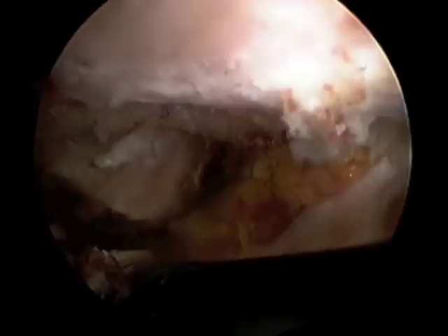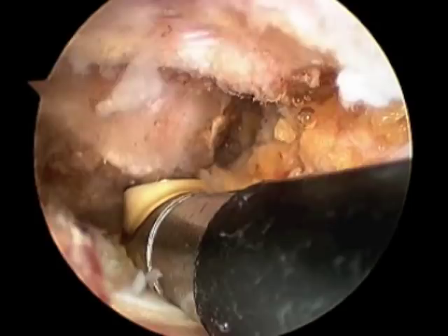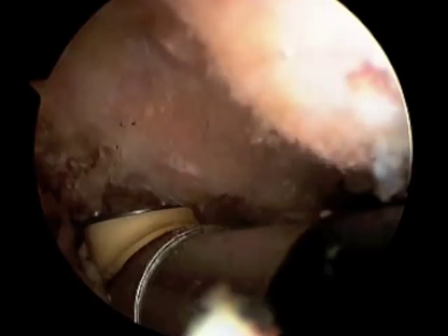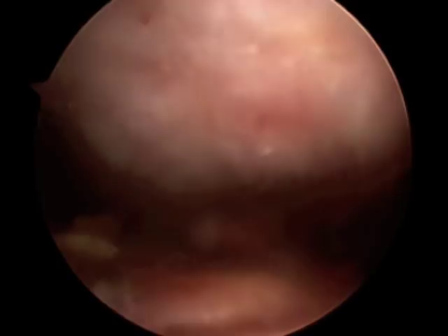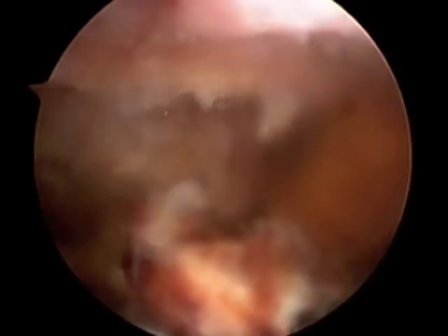This is a video looking inside a patient's right shoulder, looking from behind. The bone to our top right is the acromion, and the bone to our top left, being moved up and down by my probe, is the end of the clavicle or collarbone. The space or joint in between these two is known as the acromioclavicular joint.